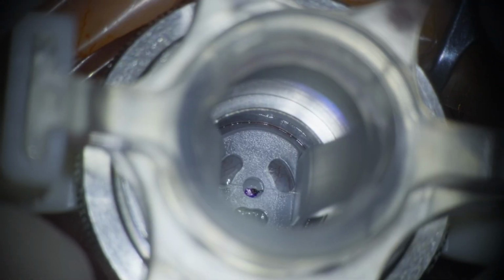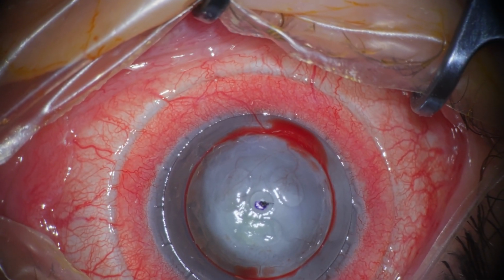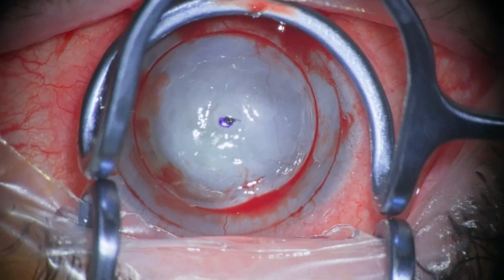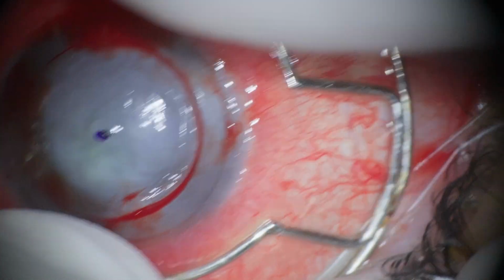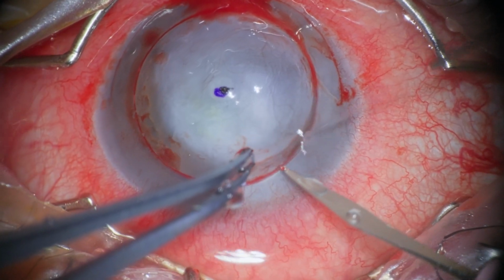If you want to have both options available, you have to do the surgery as if you're going to do a DALK, dissect as deep as possible, and then decide if you're going to conserve the endothelium or take it out. With this in mind, we headed off to surgery under general anesthesia.